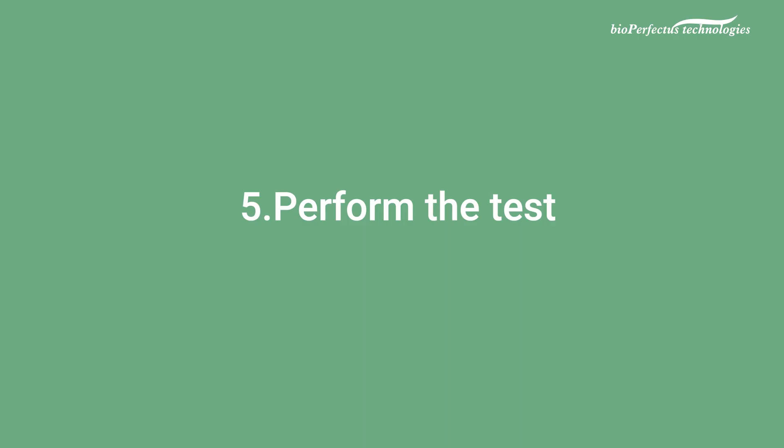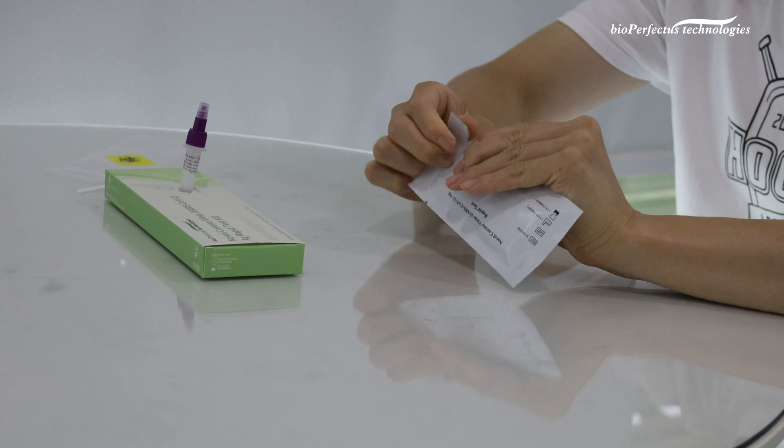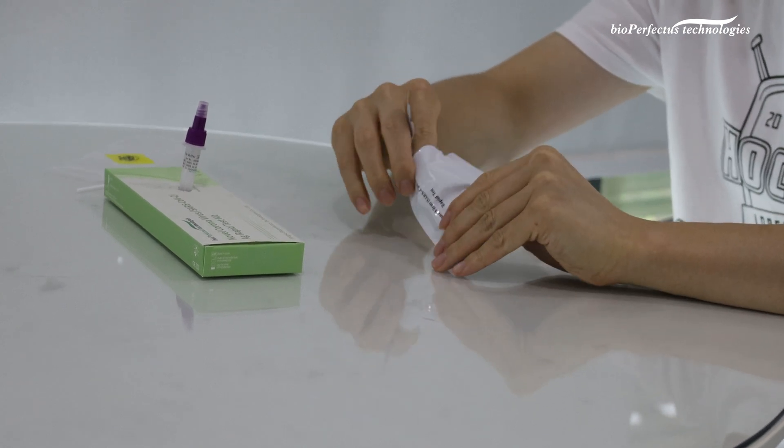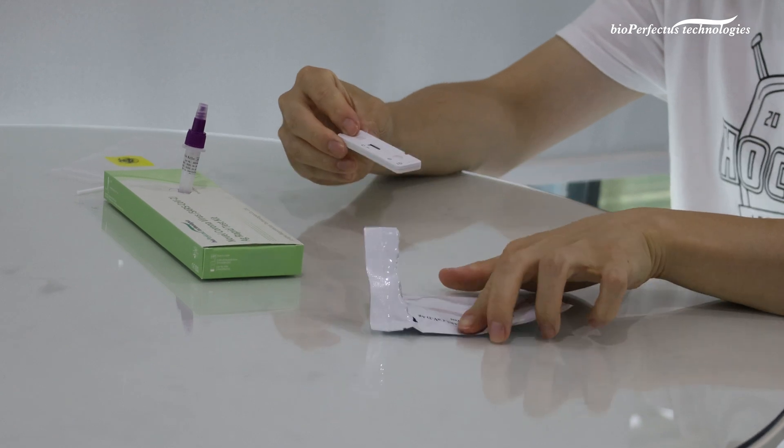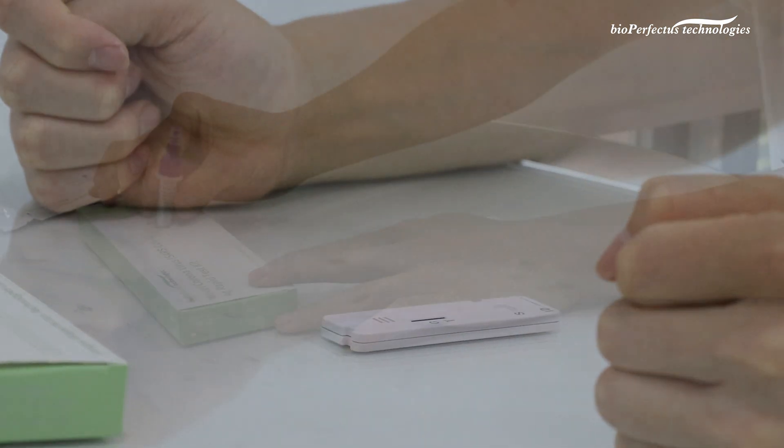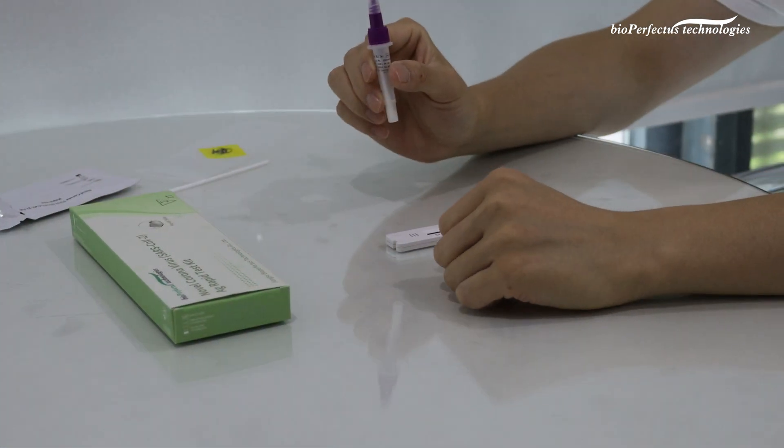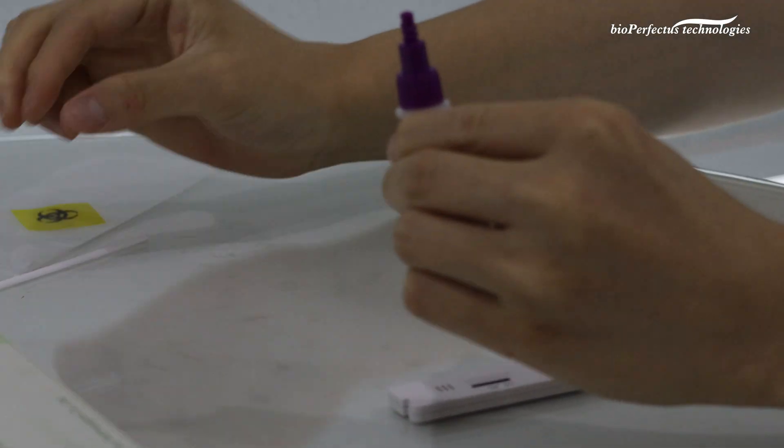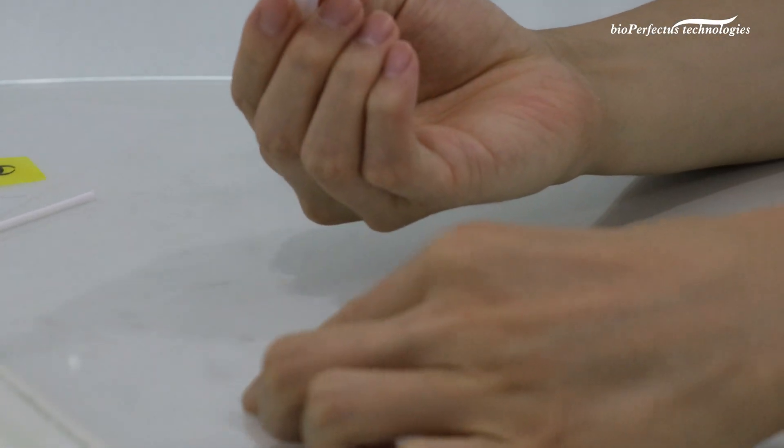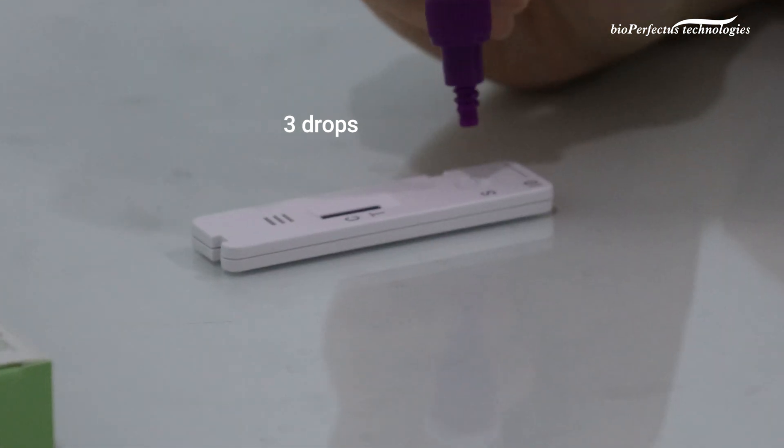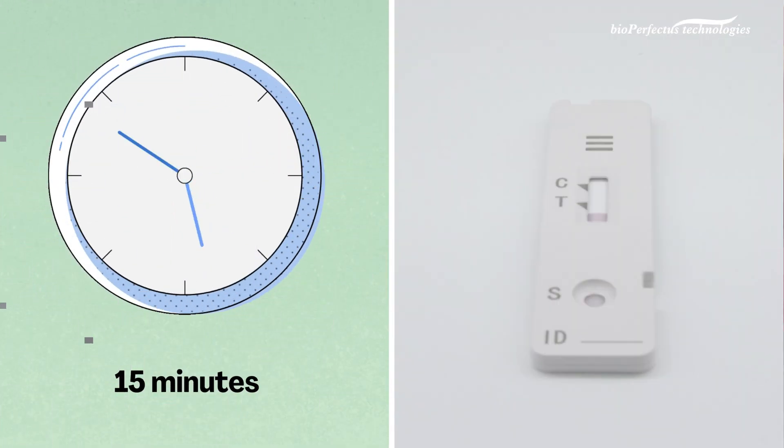Step 5: Perform the test. Remove the cassette from the foil pouch. Place it horizontally on the table. Unscrew the white lid on the top of the pre-packed extraction tube. Gently squeeze the tube to dispense 3 drops of the liquid onto the sample well of the cassette. Set the time for 15 minutes after the liquid is added.